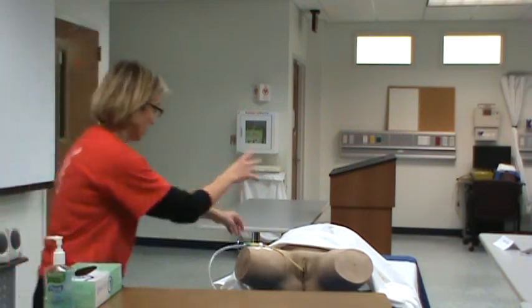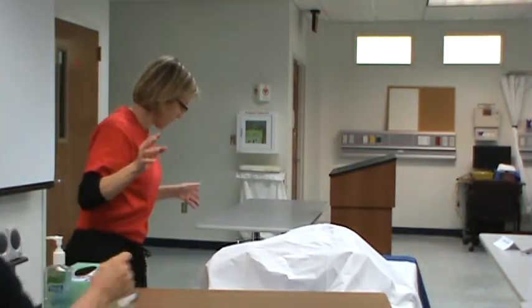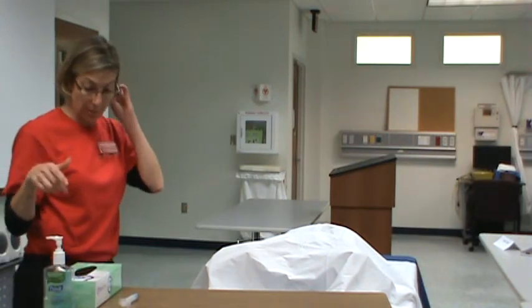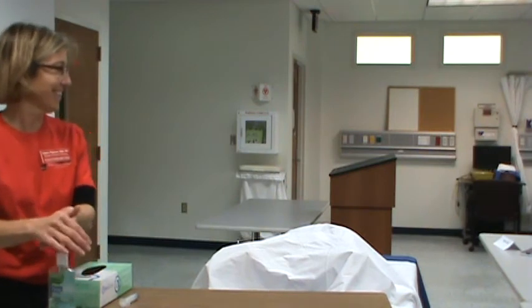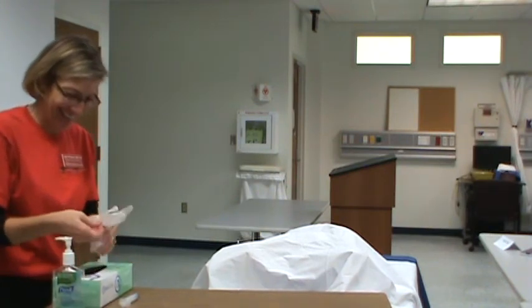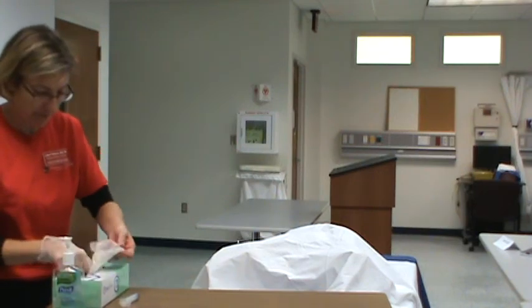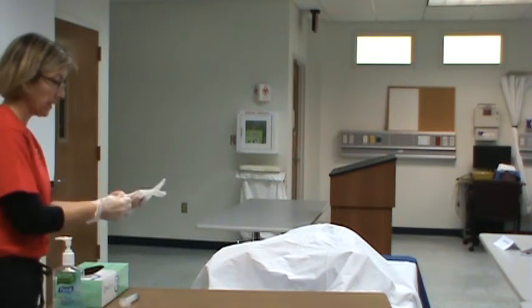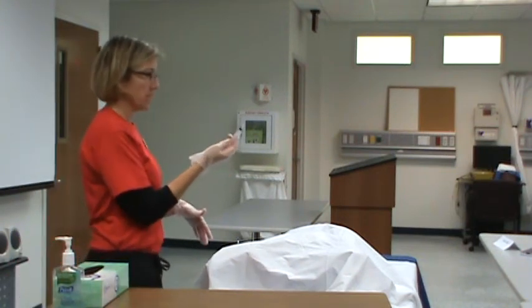Okay, so Mrs. Smith, you're going home today. I'm going to come in and remove your catheter. And Mrs. Smith says, "Yay, good. I didn't like it anyway." Hand hygiene and plain old gloves. Clean gloves is what I'm trying to say. And you'll come into the room with the syringe.